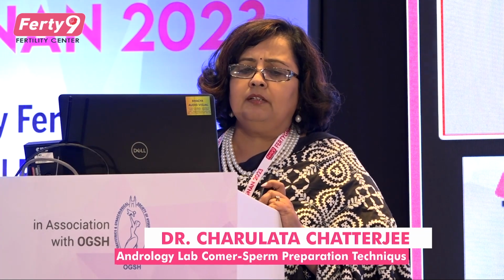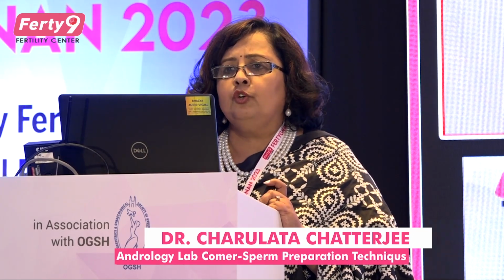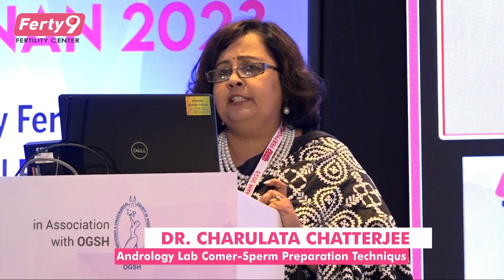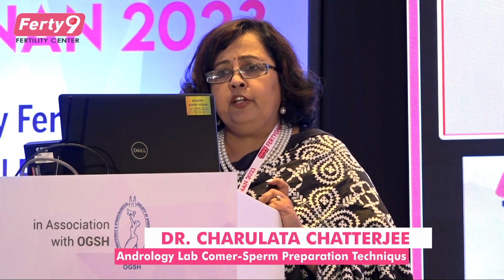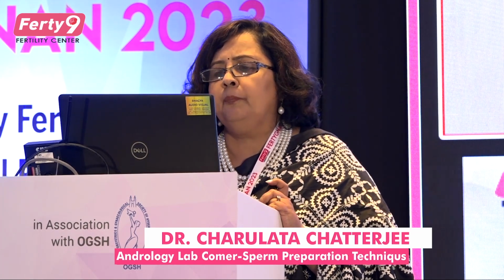This is the diagram and a video of how it works. Because there is no centrifugation involved here, there is no further sperm DNA fragmentation. We routinely do this in our laboratory, and we have seen that it has improved our outcome, not only in fertilization rate but also in pregnancy rate.